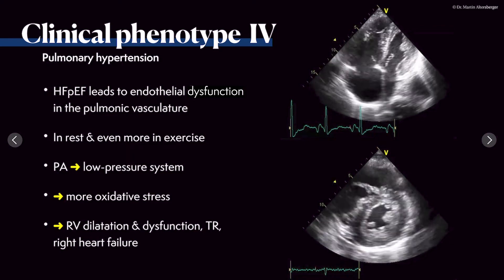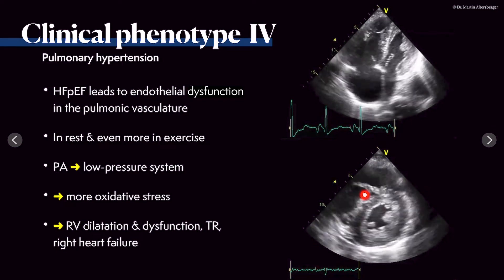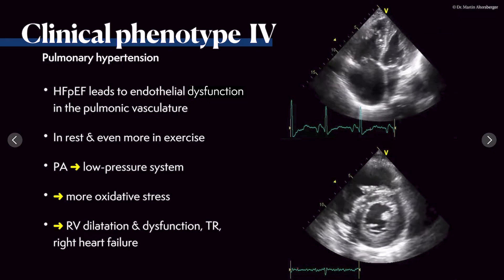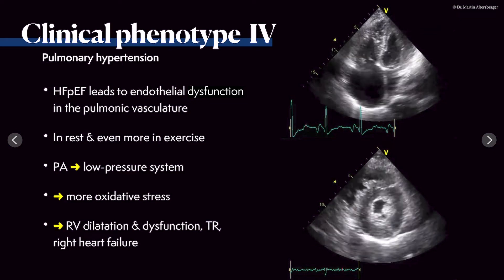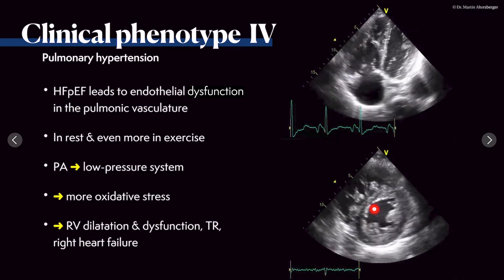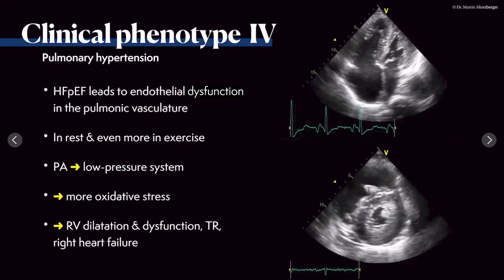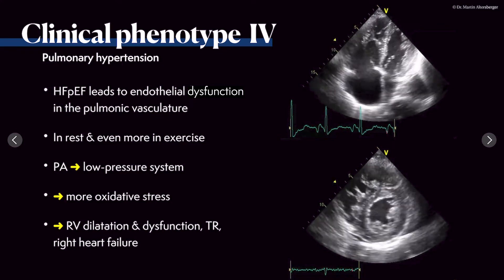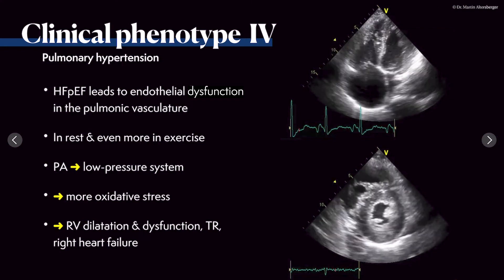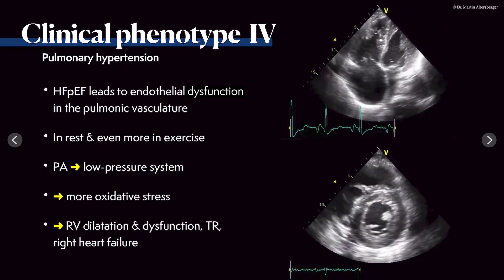In the short axis view, we also see this prominent right ventricle, the prominent trabecular system, the prominent moderator band, the small but thick left ventricle — so the small cavity with thick left ventricular walls — and the D-shape of the left ventricle, indicating elevated pulmonary pressures.